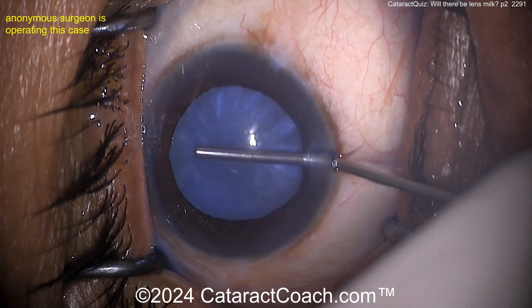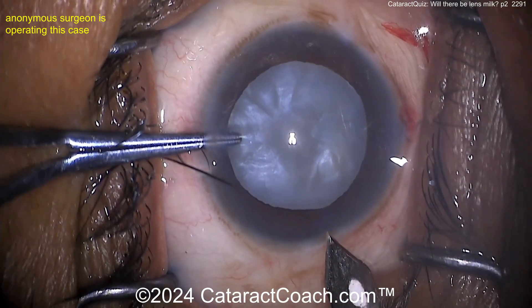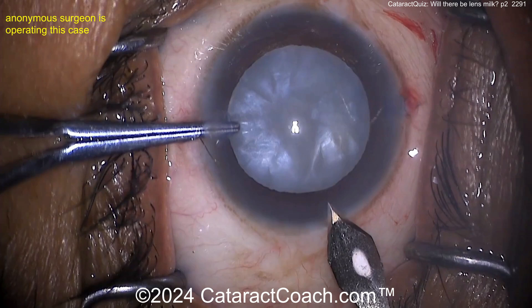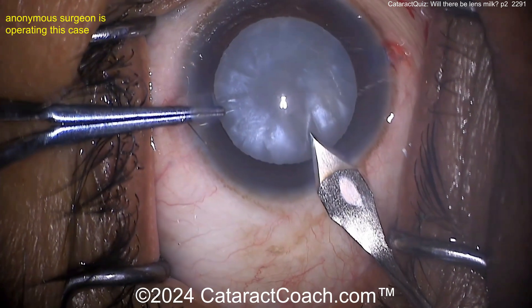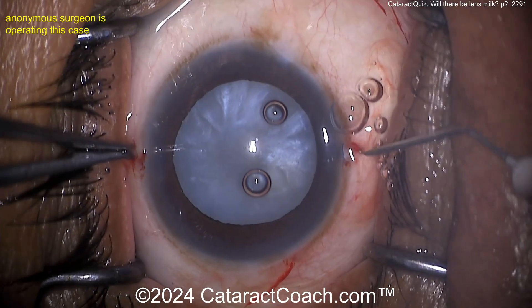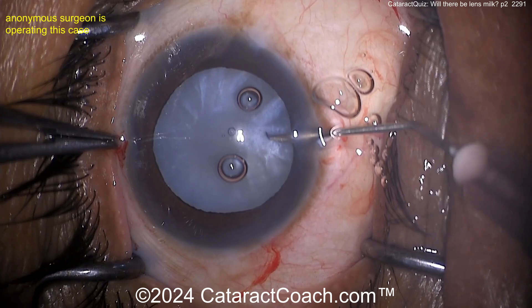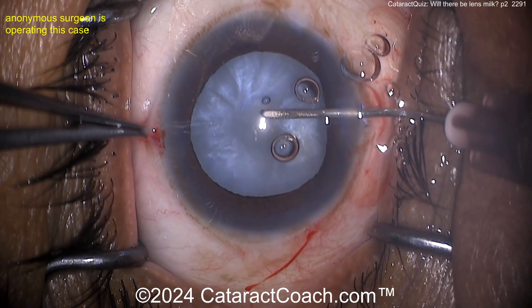Putting in some trypan blue dye. I'm trying my best not to say anything about the draping or lack thereof — I'm going to be quiet. Telling myself: shh, don't even look. Now here comes the main incision, getting this incision done.